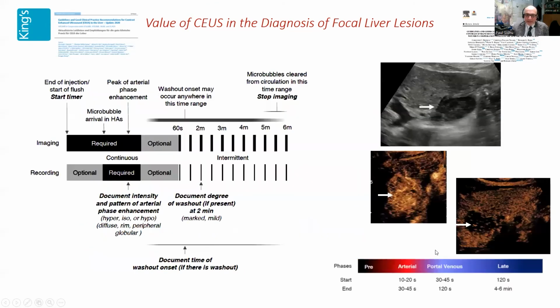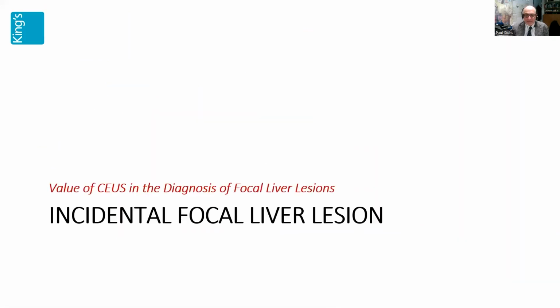And this is the algorithm to follow for imaging your injection, and you intermittently image over that period of time, because if you continuously image over that period of time, you burn out and the lesion becomes washed out prematurely or inaccurately, and you will make a misdiagnosis.